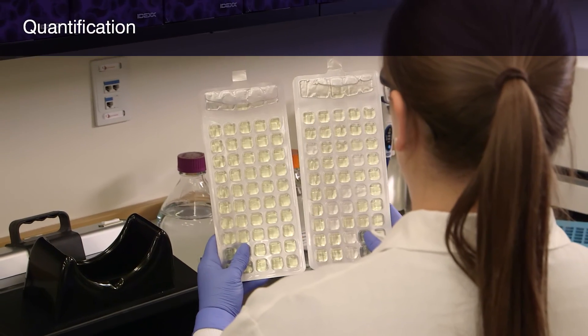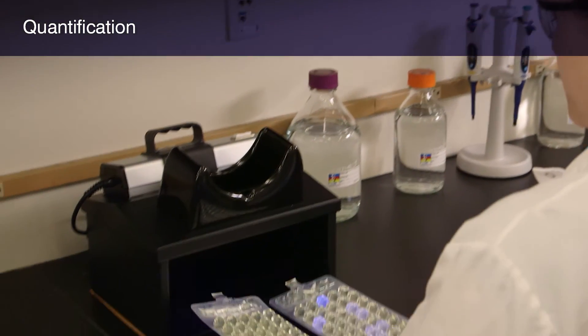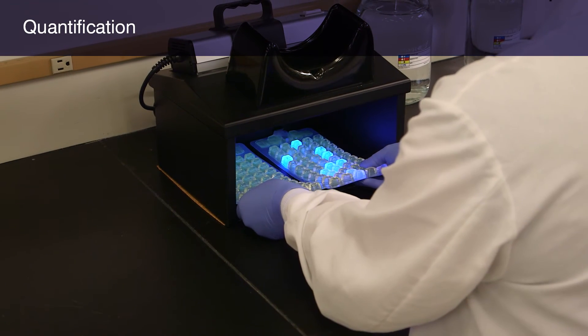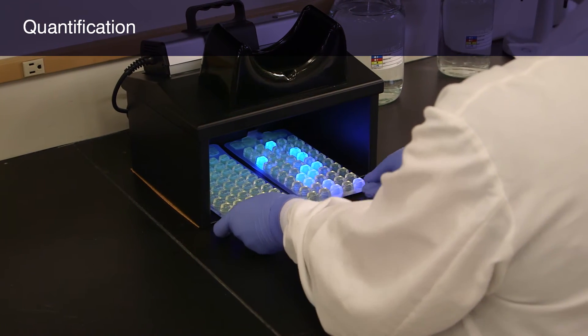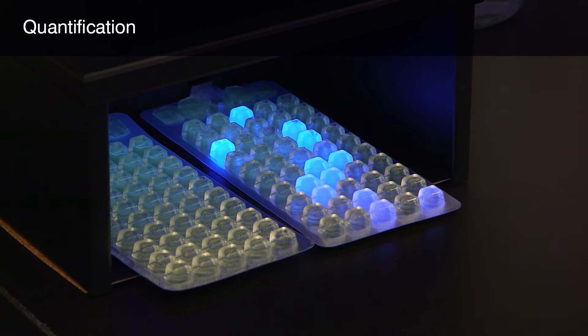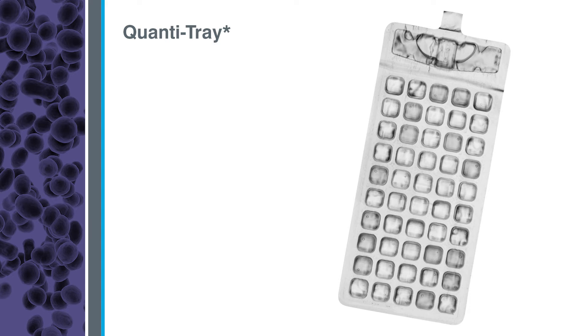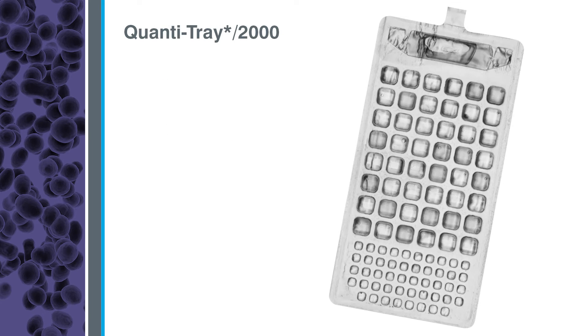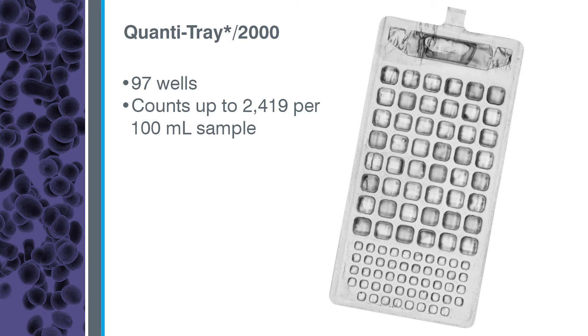Next, you'll learn to use the Enteralert test with the Quantitray system to determine the number of enterococci in a water sample. IDEXX offers two sizes of Quantitray. Both work with the Quantitray sealer. The standard Quantitray is a disposable 51-well tray that provides counts up to 200 per 100 ml sample without dilutions. The Quantitray 2000 is a disposable 97-well tray that provides counts up to 2,419 per 100 ml sample without dilutions.